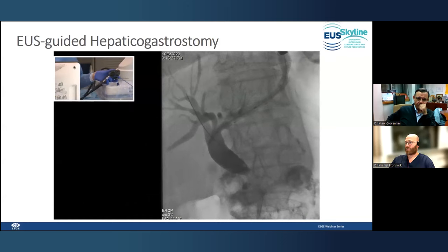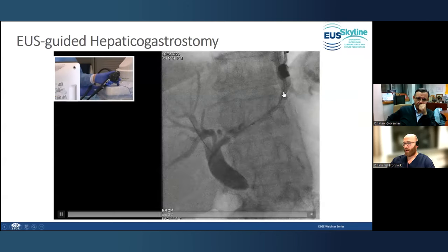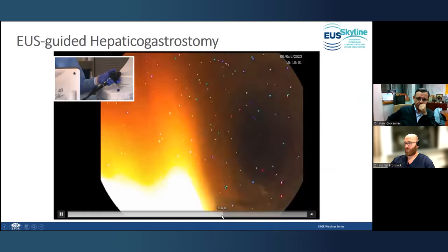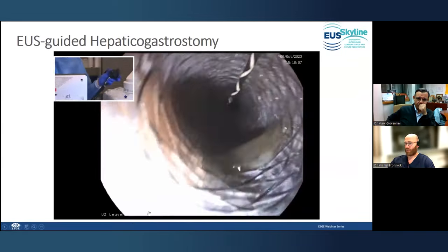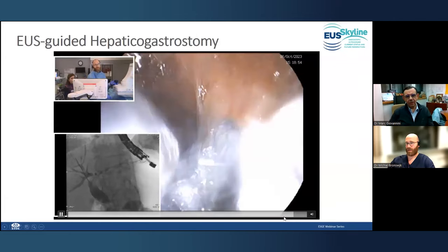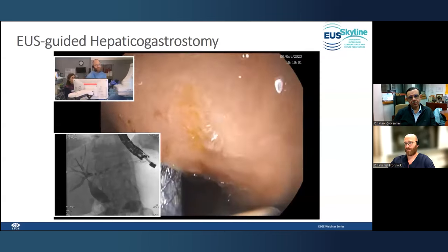You can see already some contrast running into the stomach. This is, of course, what we want to see. And what you see here is that we bridged the peritoneal cavity over here. The gastric wall is here, and now the stent is facing upward towards the esophagus. And you could say, oh no, it's pointing into the esophagus. That's no problem. What we do is we push the partially covered stent towards the gastric lumen. We're going to push it through here. And now you have your visual confirmation of adequate placement through the gastric wall. And what you want to see here as well is that you have a big piece of stent hanging out there just as a safety net for dislocation.